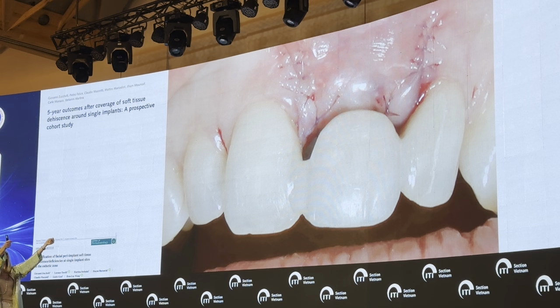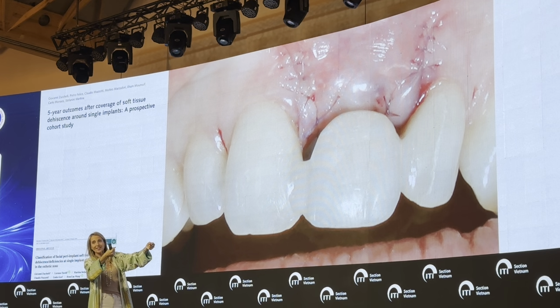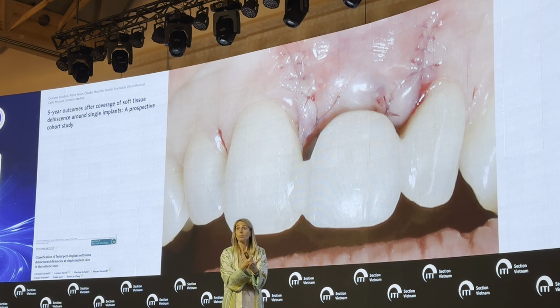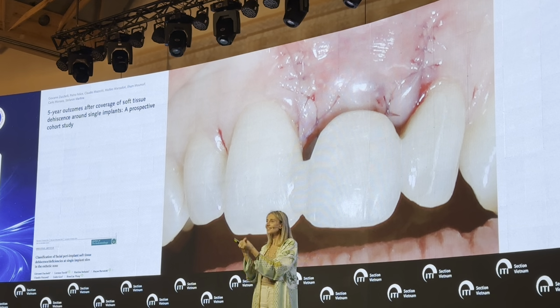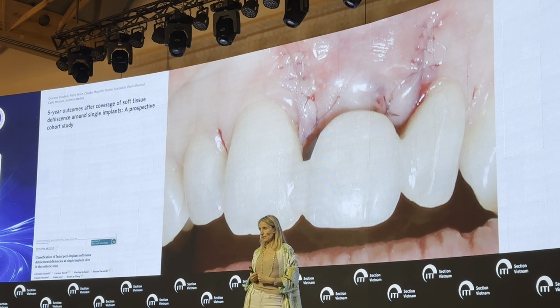So when I coronally advance my flap, I'm not coronally displacing the muscles. The vestibule depth is reduced when you coronally advance the muscles. If you simply take advantage of the fact that the alveolar mucosa, once it is completely without muscle, is made of elastic fibers, I just take advantage of the elasticity of the alveolar mucosa.